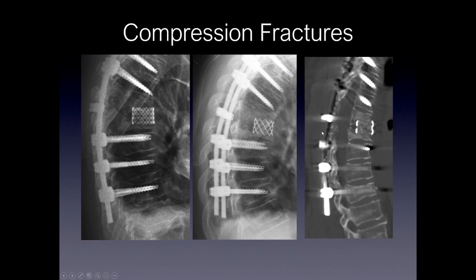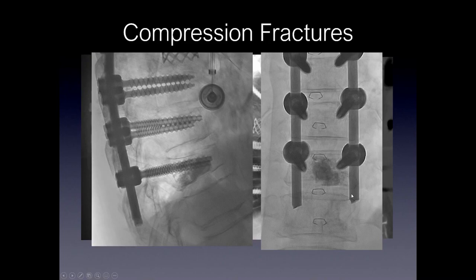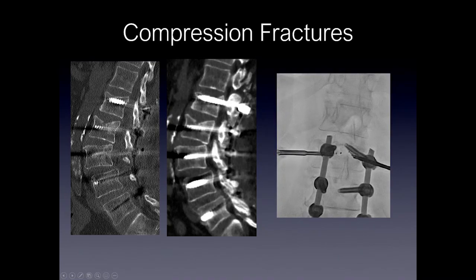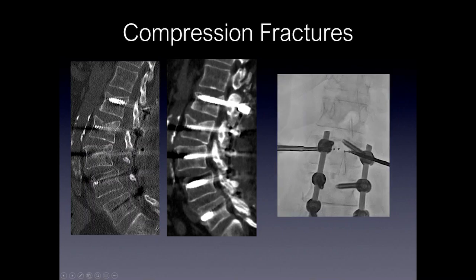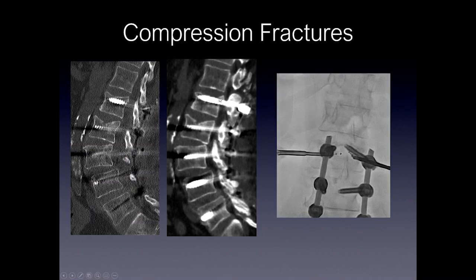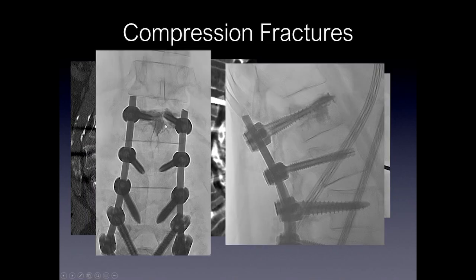Compression fractures can occur after surgery. In this case, the vertebral body had relatively normal height. The patient presented with pain, and on follow-up CT you can see a new compression fracture — this patient was treated with vertebroplasty and improved. In another example, there is collapse of the superior vertebral body height at the margin of the surgery. The patient had pain, and on this video you can see the vertebroplasty was performed — there was motion at the screw, lucency around the screw, and ultimately the patient received vertebroplasty with cement injection to stabilize the fracture.